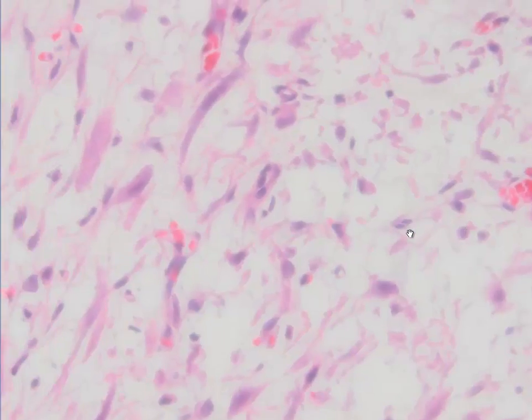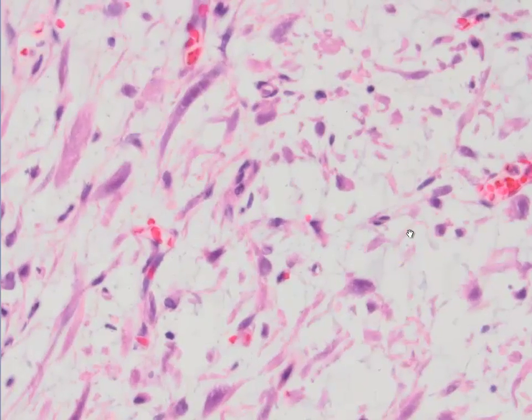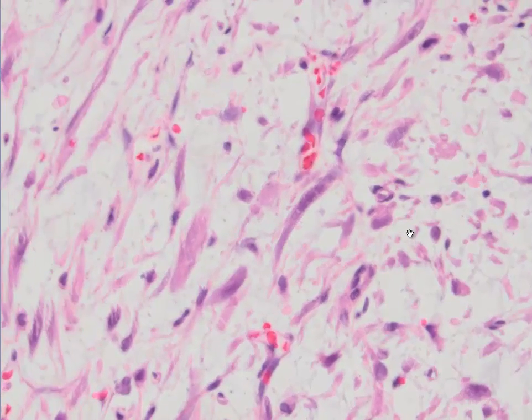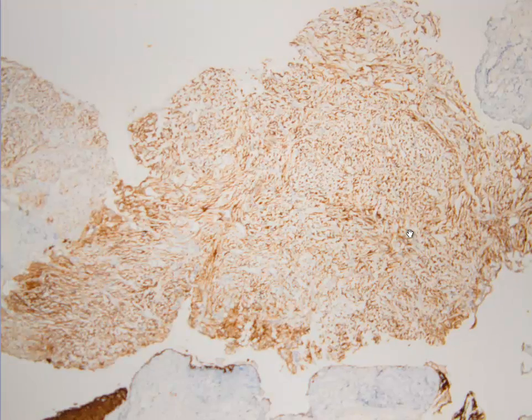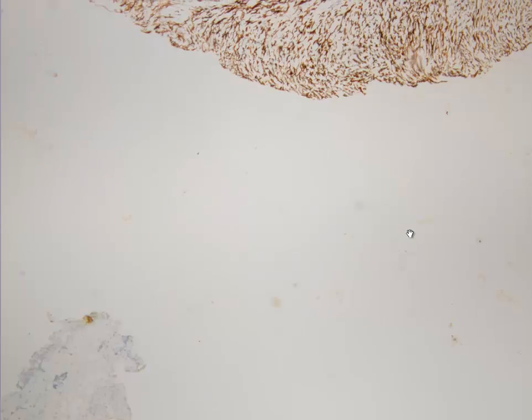with some hyperchromatic cells, and so we ordered cytokeratin here, and as you see, the surface epithelium and these cells quite stained with pan-cytokeratin. And we did another one, CK5/6 here, and that's again diffusely positive.